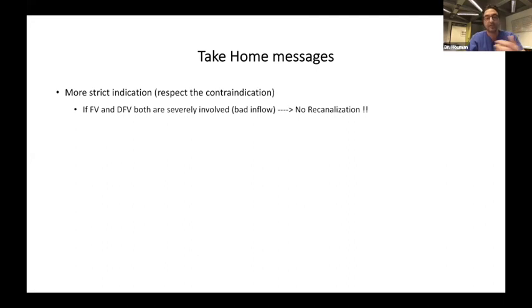Even some centers like Mark Garcia or Mert Dumantepe, and in some small patients also we did it, we can recanalize also femoral vein, but believe me, many of them are going to occlude again. So till now, there is no recommendation for the daily work.